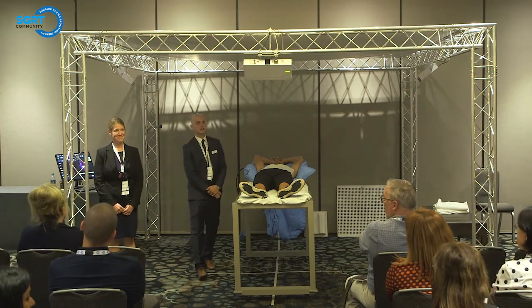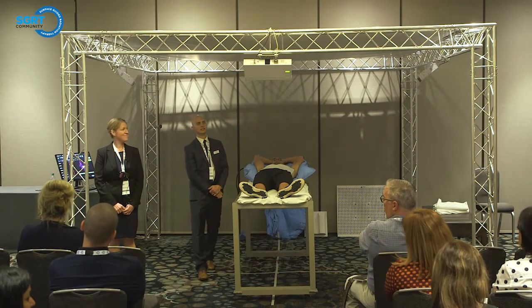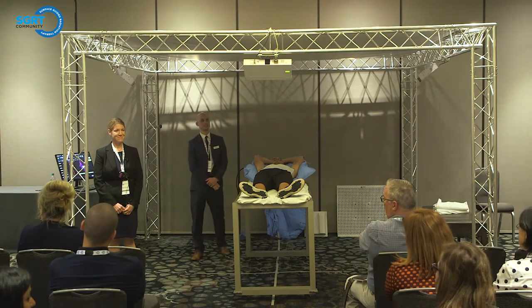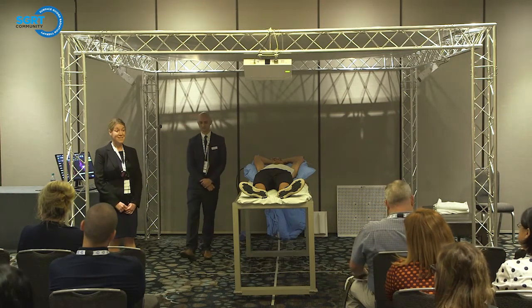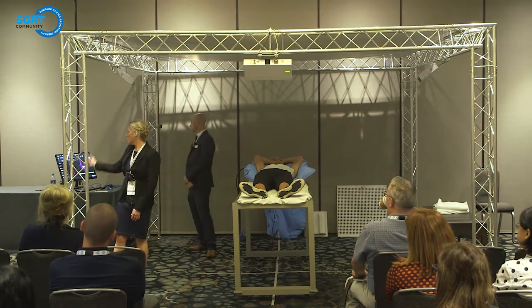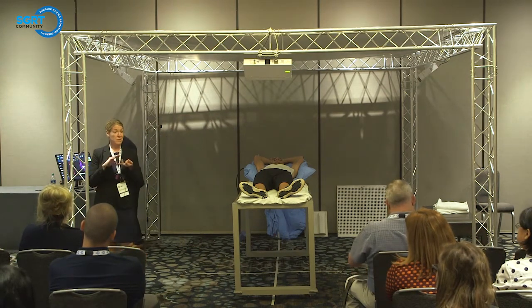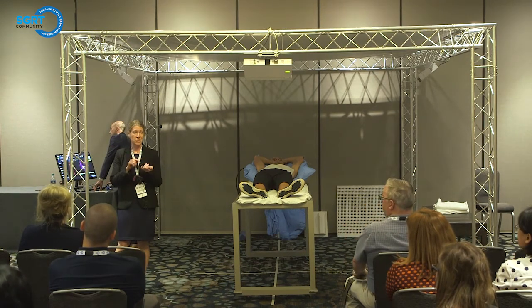Does the light reflected in the mirror, the camera captures, depend on the color of the skin? Yeah, it does. Up in the corner, we have the skin tones. You can choose a fair, mid, or dark skin tone. You do want the correct skin tone for your patient, so it will optimize your cameras.